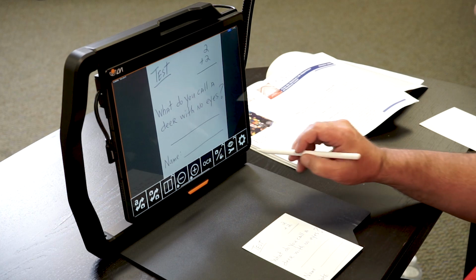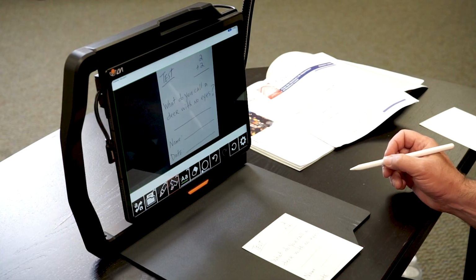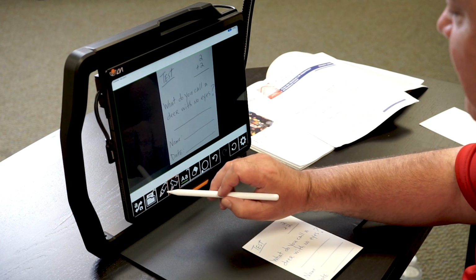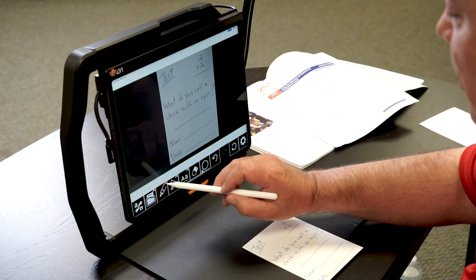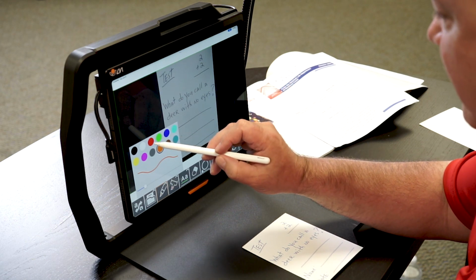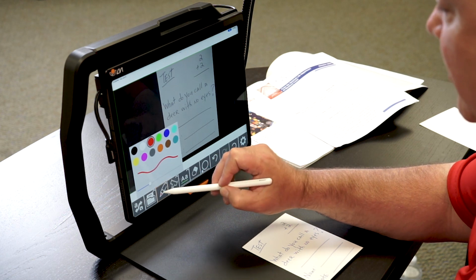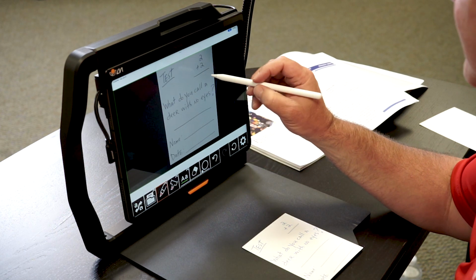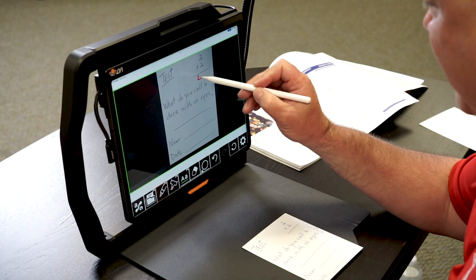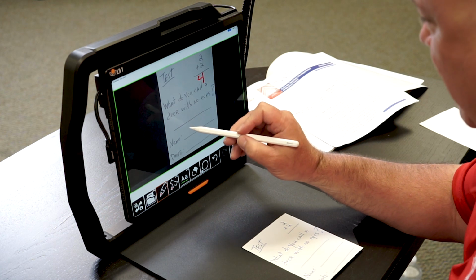What we'll do now is we'll tap on the writing button. It makes a snapshot of that. So now we're going to go back to the document. We're going to tap on the marker. Let's see which one we want. I think we want to use the red marker, and we're going to make that line a little bit thicker, and then we're going to answer the question. So the first one is a math question for this test, and so we'll put the answer there. Okay? I forgot to put my name on it, so we'll put my name here.